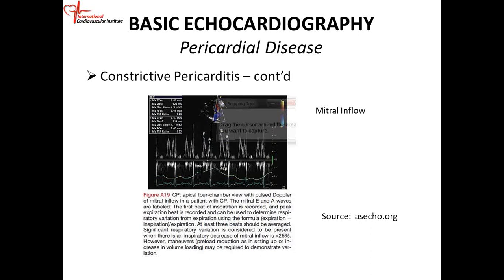Your septal bounce is different. It's different because it's a respiratory thing. Your septal bounce is different from paradoxical septum because it's a respiratory thing. Okay, with inspiration, it's going to move to the left. With expiration, it's going to move to the right. It's different. So never call it paradoxical septum. Paradoxical septum is the septum is going to move in a paradoxical fashion per beat. All right.